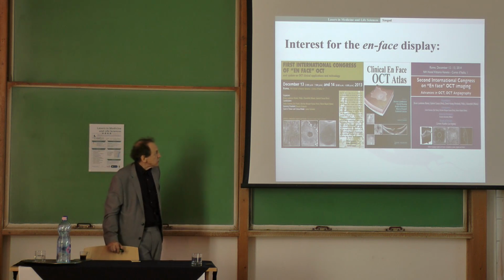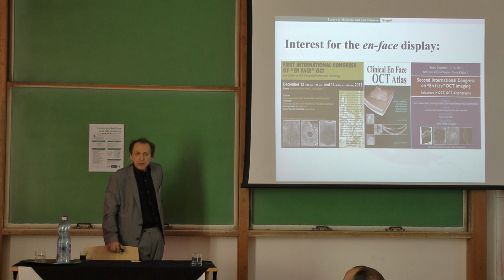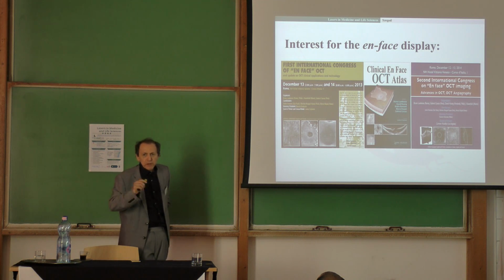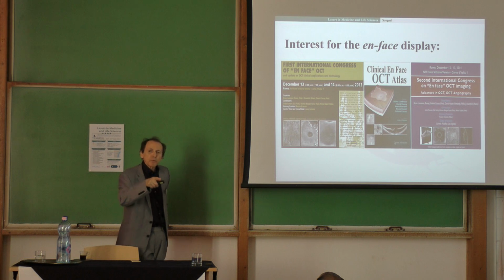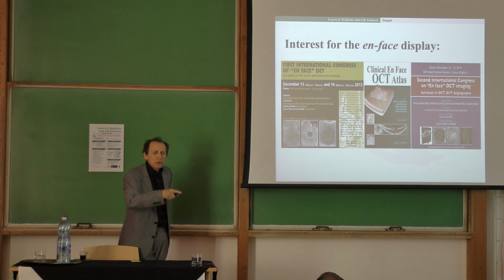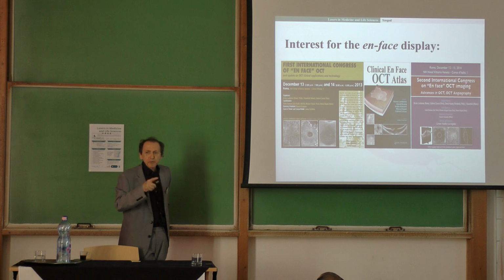Now, using OCT, you don't need to inject. You can see the vessels simply, because OCT is based on interference. I.e., you do interference of two beams. It's like heterodyne. You superpose two waves. It's like beating. So if there is anything moving, that bit will create a Doppler shift. So if you now look at that bit, you can identify that signal came from a vessel, from a flow scattering center which was moving.